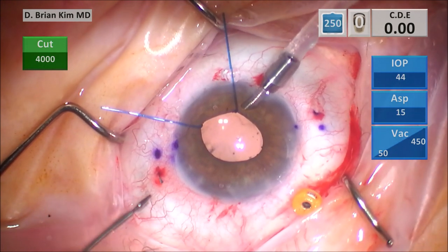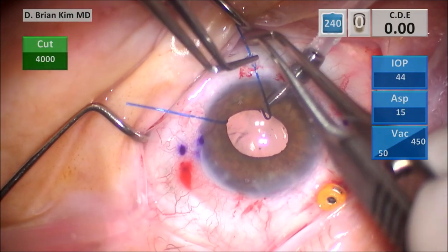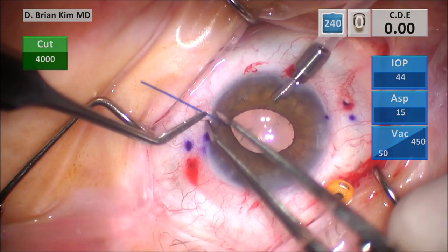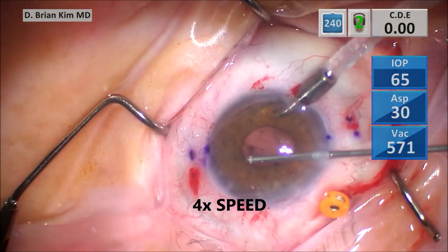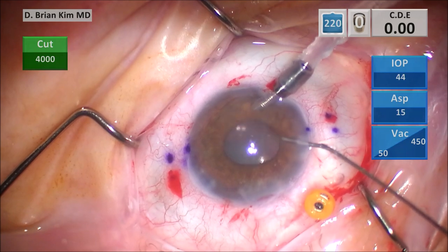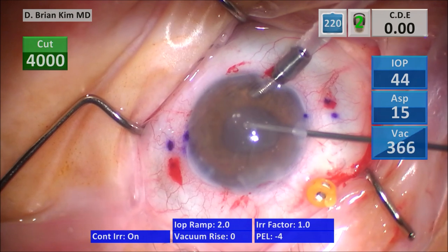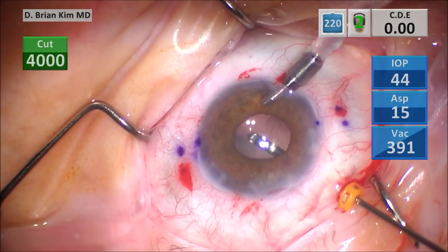I'm taking out each of the iris hooks. Now I'm switching to cortex mode and I'm able to remove the viscoelastic from the anterior chamber. Number eight: you can inject intracameral triamcinolone after you remove the viscoelastic from the anterior chamber to ensure there is no vitreous in the anterior chamber. You can certainly use miochol to constrict the pupil, but triamcinolone gives you direct visualization of the vitreous, plus it also helps with controlling inflammation. We're going to inject some intracameral triamcinolone, and then using the vitrector, we're going to do the anterior vitrectomy. You can see there's absolutely no vitreous in the anterior chamber, and then I do some more vitrectomy in the posterior segment.